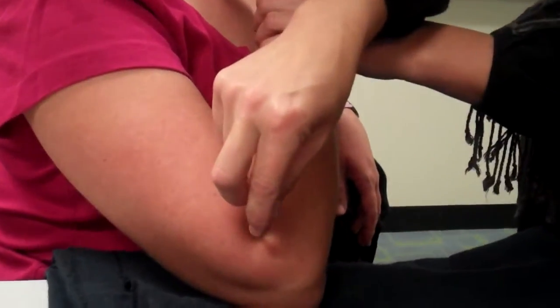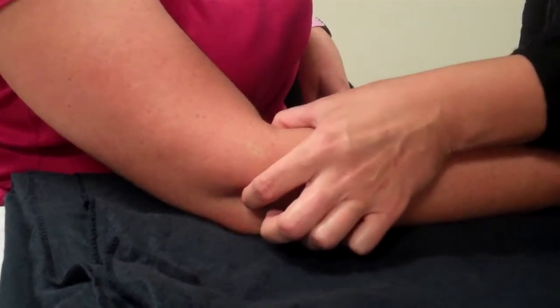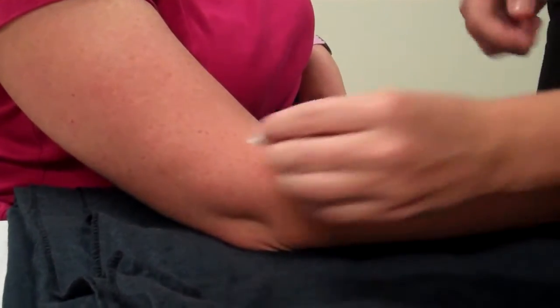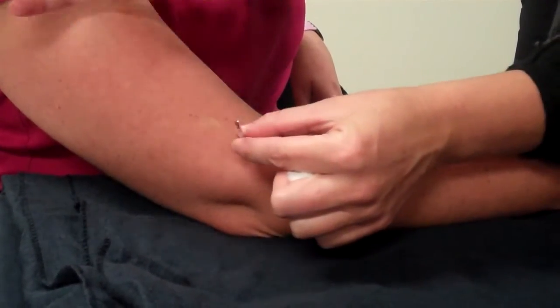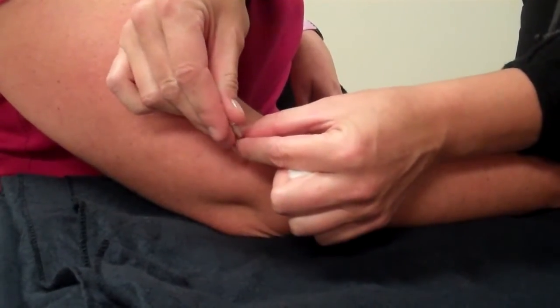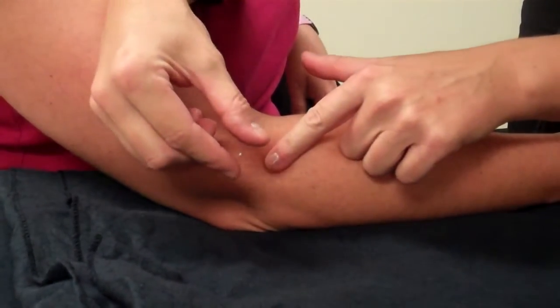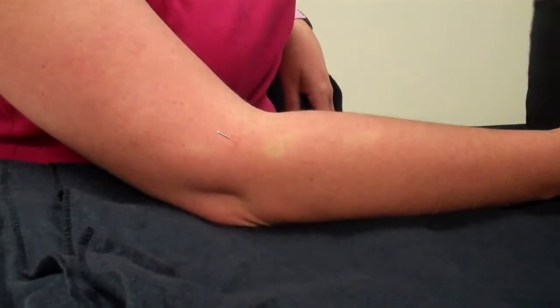Reference: bend the elbow and look where the crease ends. Nine times out of ten, it's the same spot. So again, you're swabbing with the alcohol. You've got your spot — not touching the needle — take the tab out, tap it in. You can touch the skin on either side of it if you like, and just inserting the needle straight in.